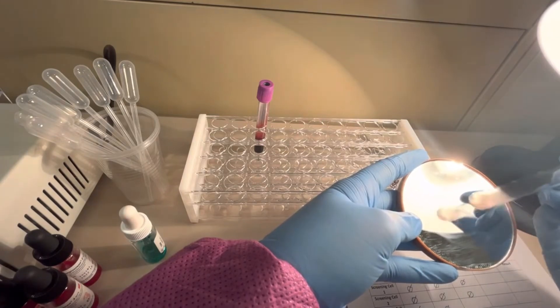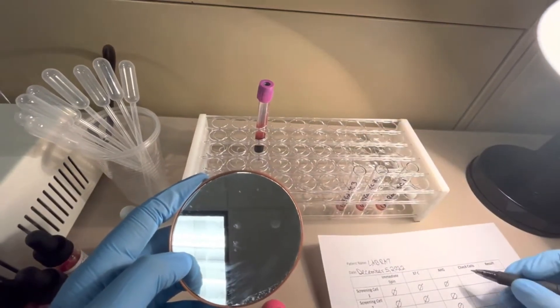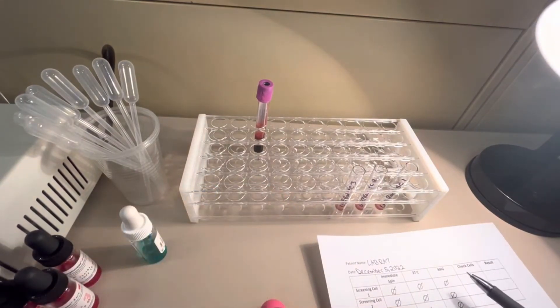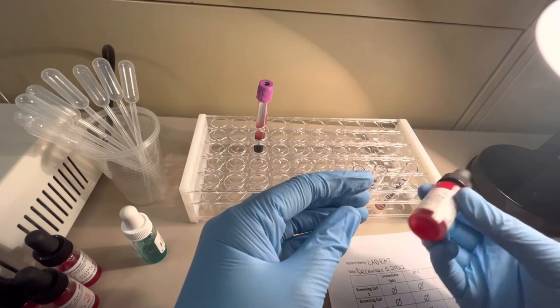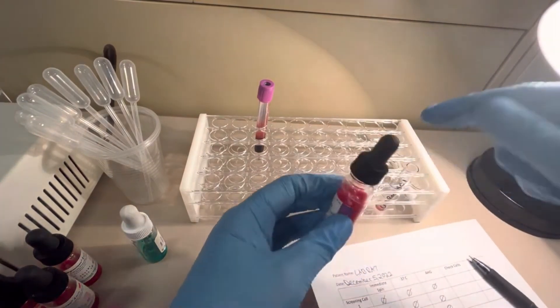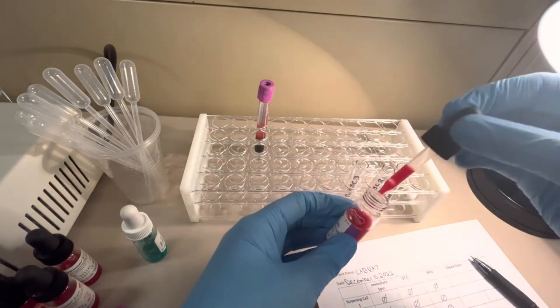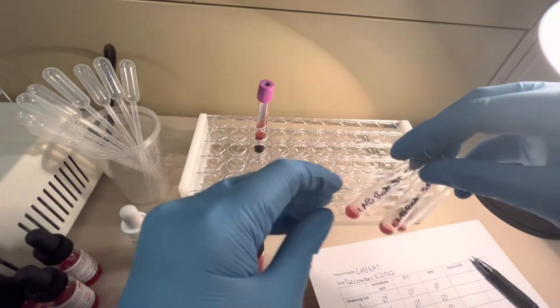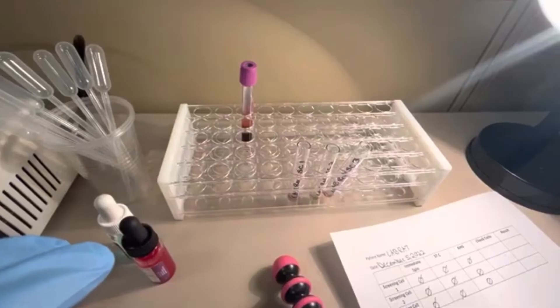Are we done? No. We need to QC the AHG reagent by adding check cells. Check cells are IgG-coated red blood cells — they will bind with the AHG and cause agglutination if the AHG is working properly. For every negative AHG result you must add check cells to confirm the reagent worked. I'll add one drop of check cells to each of the three negative tubes, centrifuge for 15 seconds, and then read them.